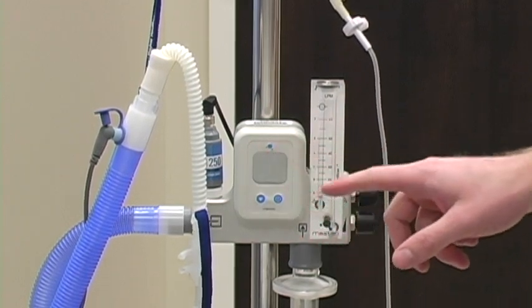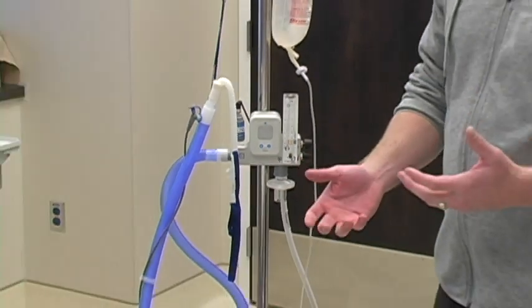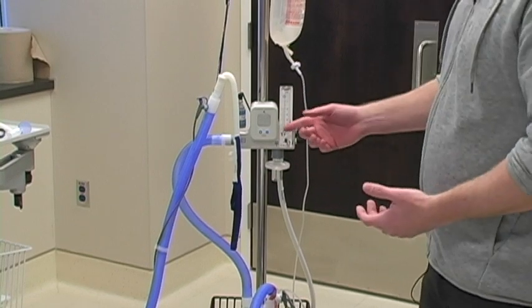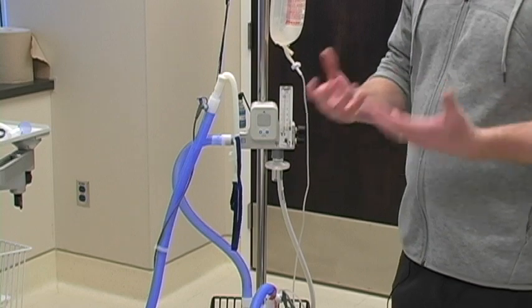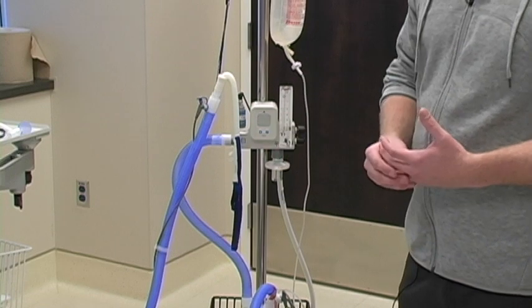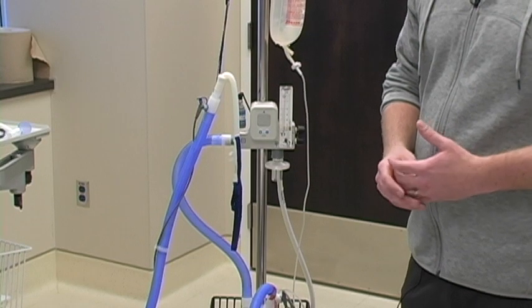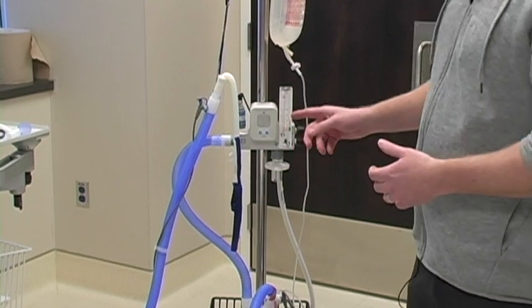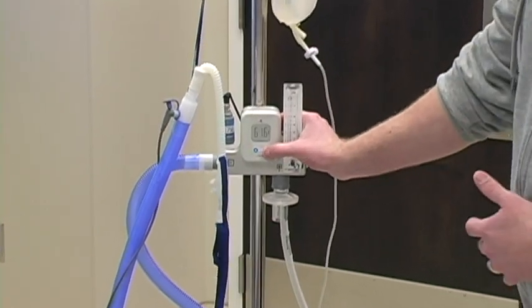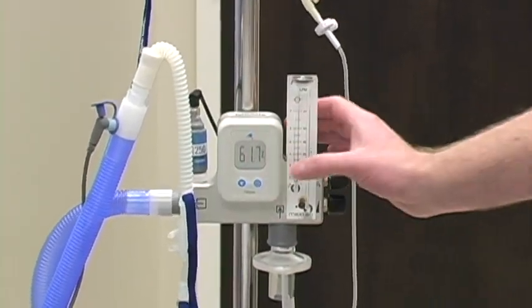So the nice thing about the Optiflow is you can adjust the flow of gas to the patient and the percentage of oxygen in that gas separate from each other. So if you wanted to increase the flow to try to improve their volume in their breaths or wash out their CO2 more, then you can do that and keep the oxygen concentration the same. Or if you're happy with your flow but you felt like their sats are maybe a little bit low and you wanted to give them some more oxygen, you could do that independently of the flow. Kind of a nice thing about it. The only real button to push is this one, which turns it on, and you'll get your oxygen percentage reading right here on this screen.